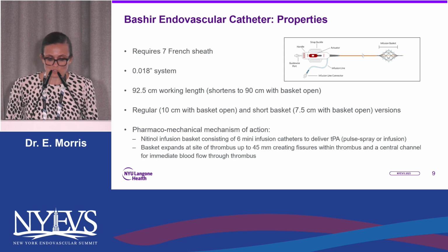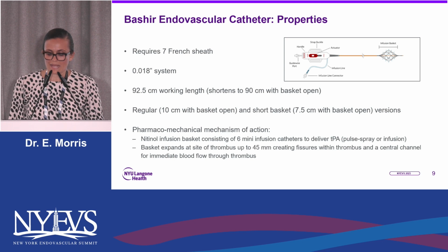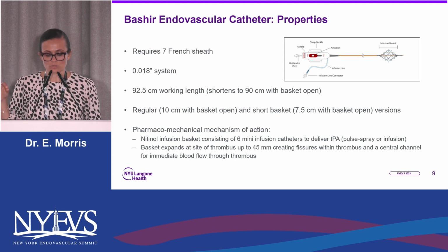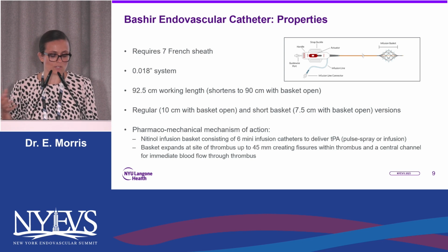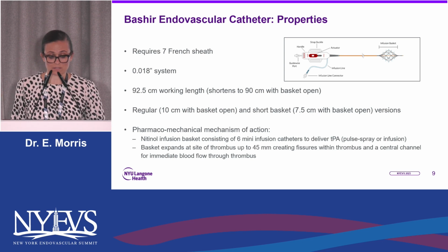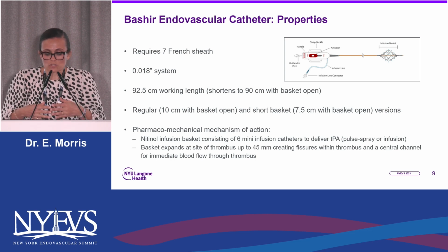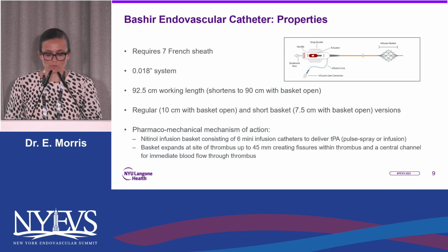So it's a nitinol infusion basket. There's 6 mini infusion catheters. Each has 8 holes in it to either pulse spray or infuse slowly your medication, which in our instances is TPA. The basket expands at the site of the thrombus, so within the thrombus, up to 45 millimeters.